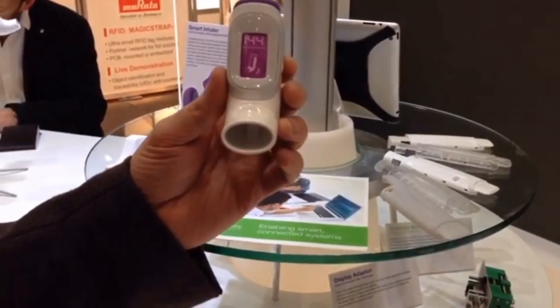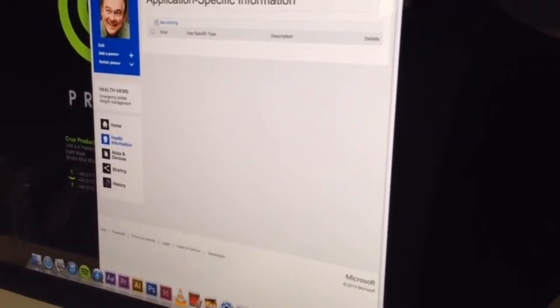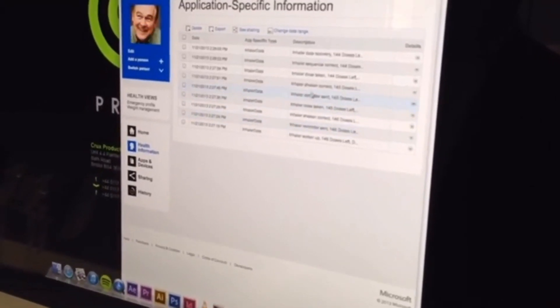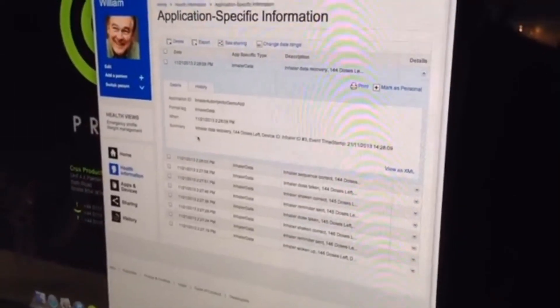And now this is a cool bit. It is an indication that it is transmitting the data of how we have taken the drug and the doses left over into the Microsoft Health Force system. So if I just refresh this page, we should be able to see the data from the dose that we just simulated. We can see a whole sequence of events, including the number of doses left, and that matches the display of the device itself. If we expand one of these, we can see the additional information — it is a health record, including the unique device ID and the timestamp.